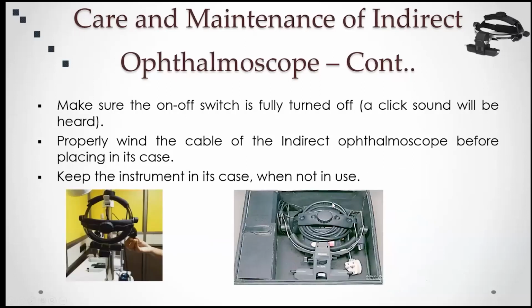And once the examination is over, make sure the on-off switch is fully turned off. To ensure it, a click sound will be heard. Also properly wind the cable of the indirect ophthalmoscope as well as the power supply, and keep them safely in its case at the end of the day.